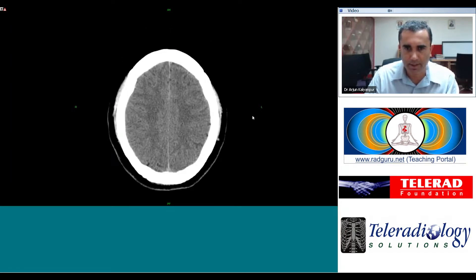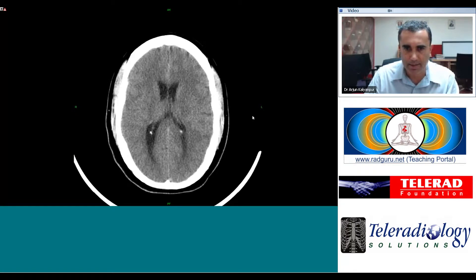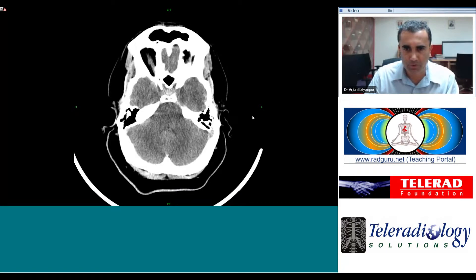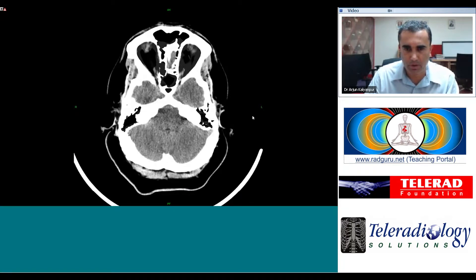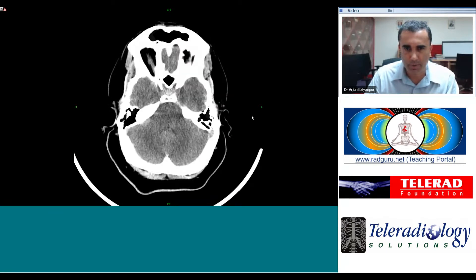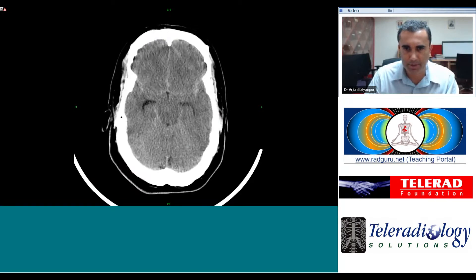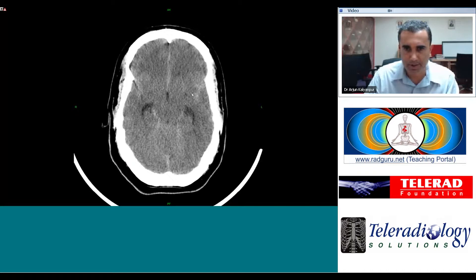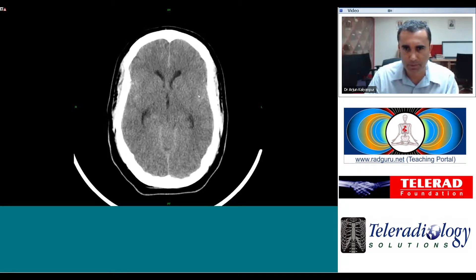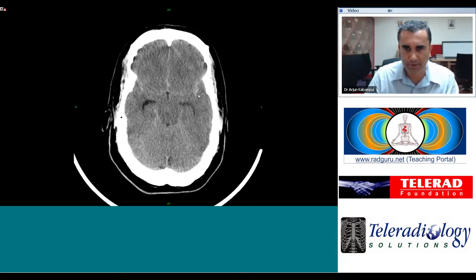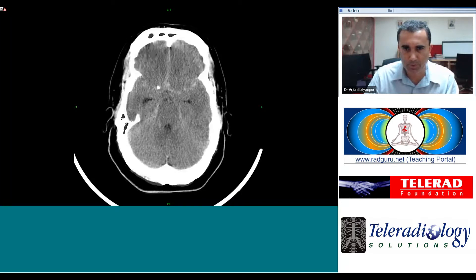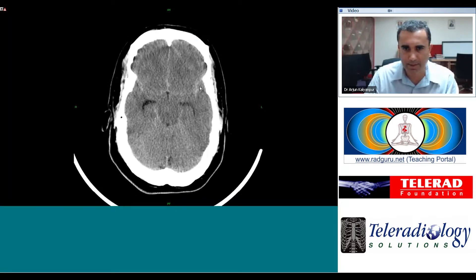As we scroll through from caudal to cranial, we notice that there is hyperdense material within the cerebral sulci, most notably in the sylvian fissure on both sides, as well as the anterior inter-hemispheric fissure.